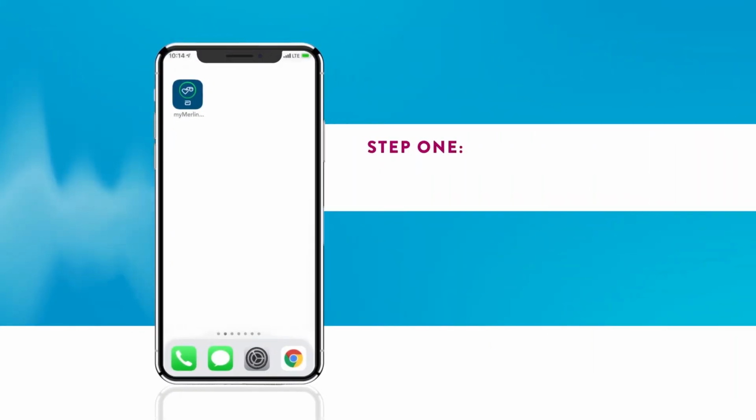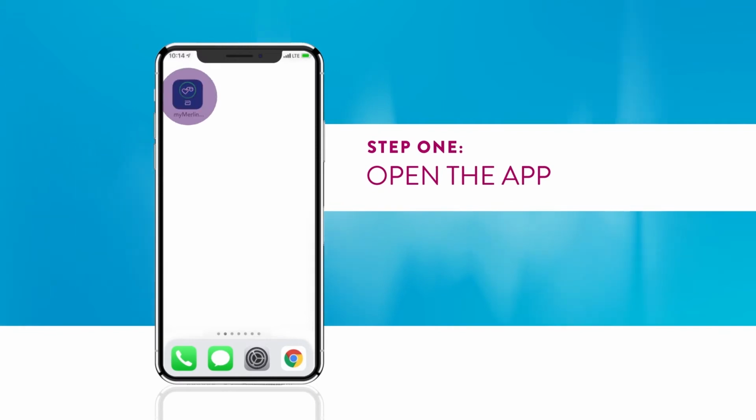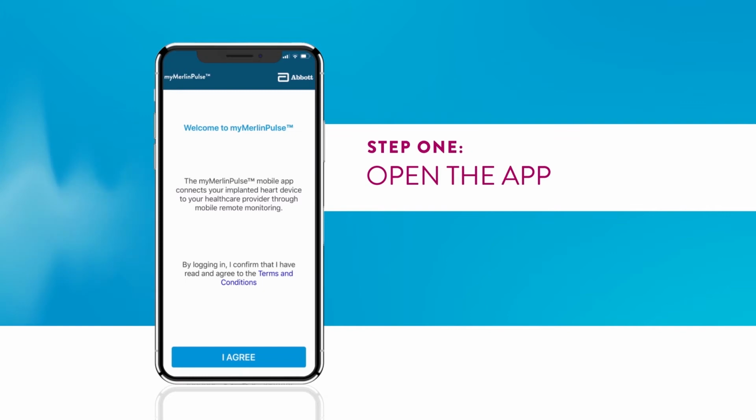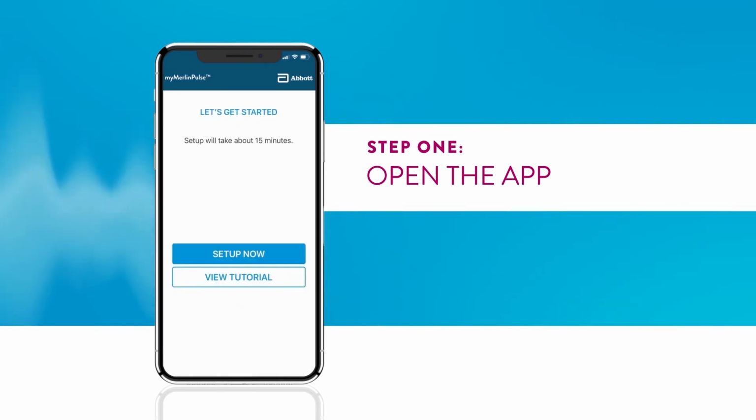Step 1. To start the pairing process, open the myMerlinPulse app. If this is your first time pairing the app, when you open it, you'll see a pop-up that asks if the myMerlinPulse app can send you notifications. Click Allow. You will then see a screen that asks you to confirm that you've read the terms and conditions. After you review the terms, click I agree. When you get to the screen that says Let's get started, click Set up now.